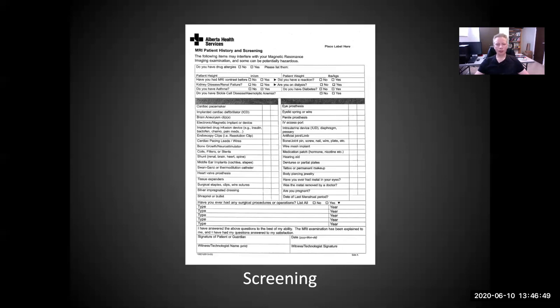In terms of patient height and weight, most of the time we are not too concerned about patient height, but we still want it to be filled in. But weight is very critical because the MR scanner is calibrated according to weight in order to make sure that we don't put too much energy into the subject. I'll talk a bit more about that later, but you do need to ensure that, especially for children where a guesstimate is not good enough, we really want them to be weighed on a weigh scale, and that you put in that weight here and mark it as pounds or kilograms.